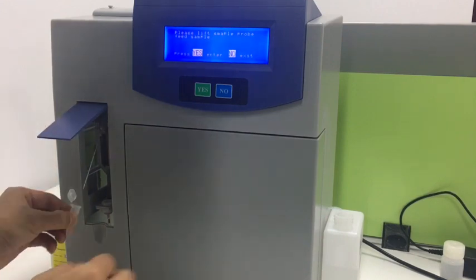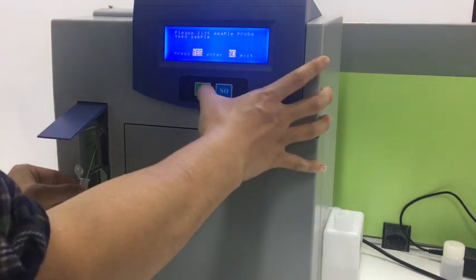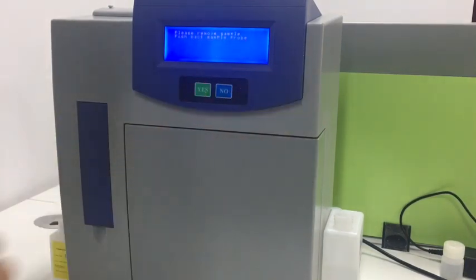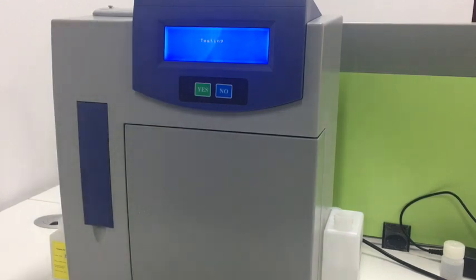We will lift the sample probe and feed the solution, then press yes. Close the sample probe. It will test automatically. This is the test result of the solution. We can compare it with the target value of the QC solution.